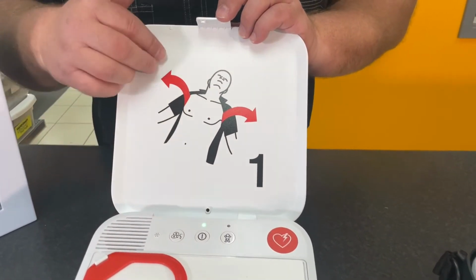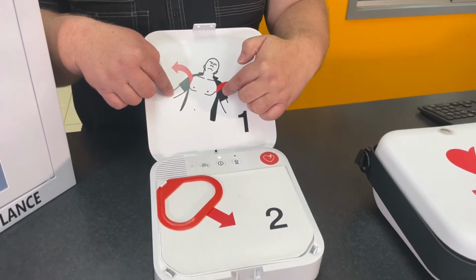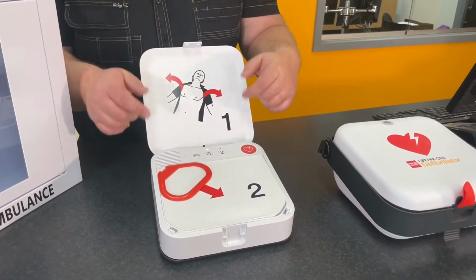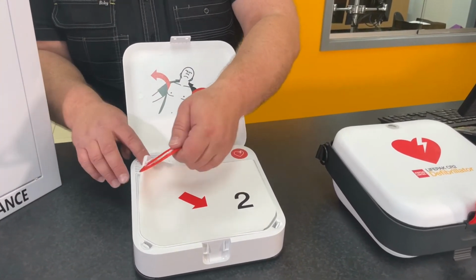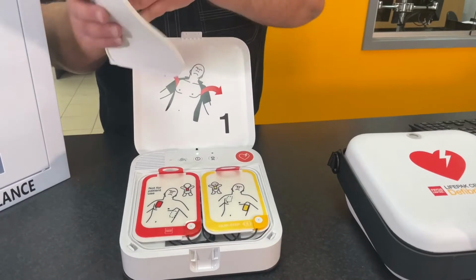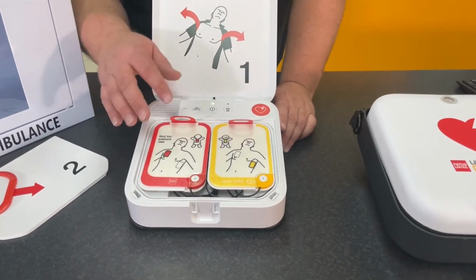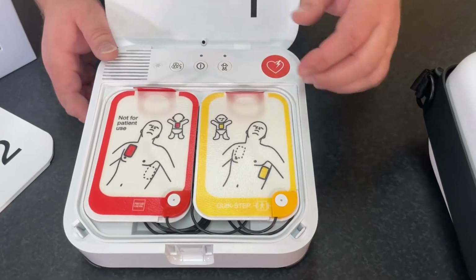So in addition to that voice, I can see straight away, number one, I need to open the clothing on the chest of the person that suffered the sudden cardiac arrest to access the chest. Then number two, I'm going to remove that tab. It's very obvious to pick up that tab and pull that open. Now that allows me to access the pads that are contained here. So there's no other packaging or nothing to insert or nothing to do differently.